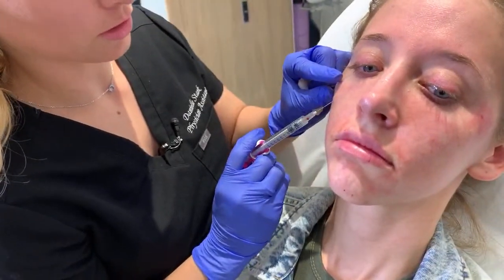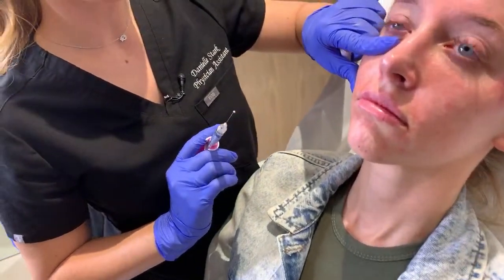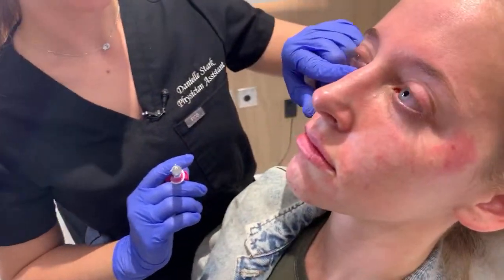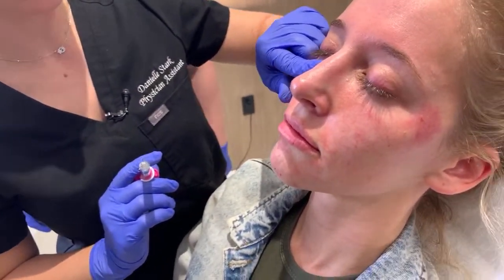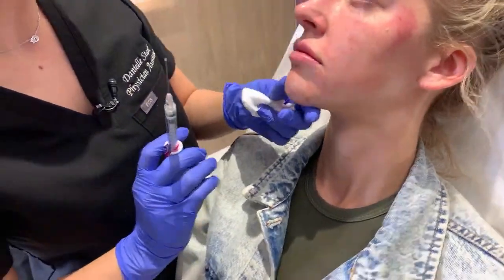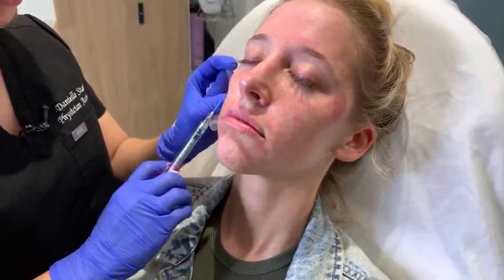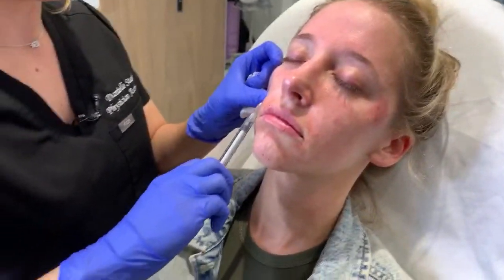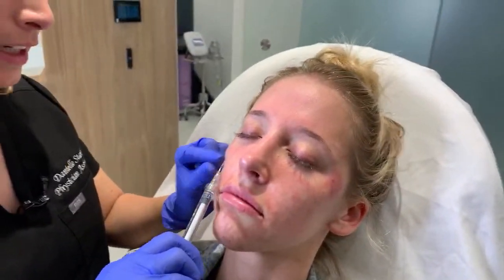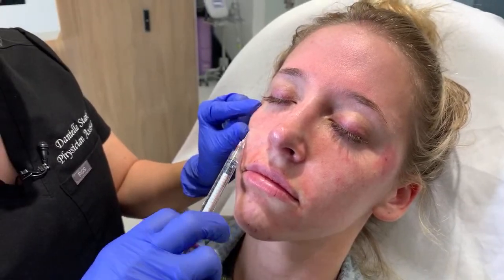I definitely want patients to move around as I'm injecting them, make expressions, see how their face changes. Some products move around really well with facial movement, and others are more rigid and good for building up structure. So that plays a big role in how we choose. Last little spot here. With these fillers, they now pretty much all have numbing inside the actual filler, and you can feel it. So when we're numbing from the inside, her lashes are feeling funny.